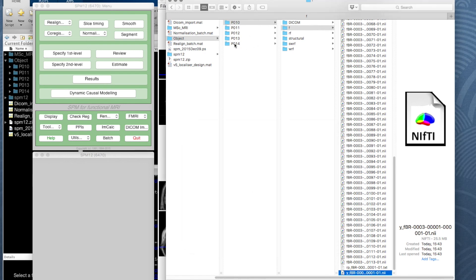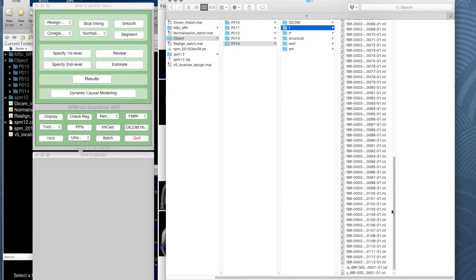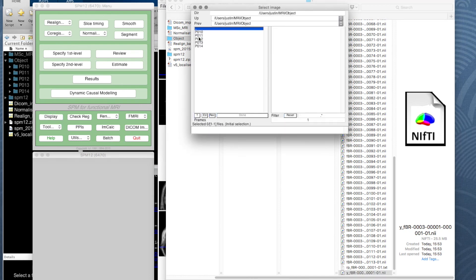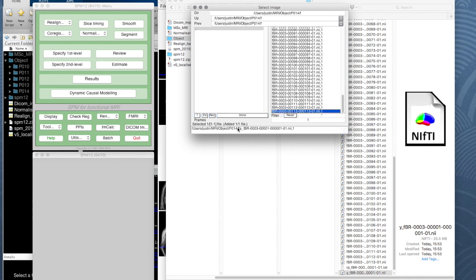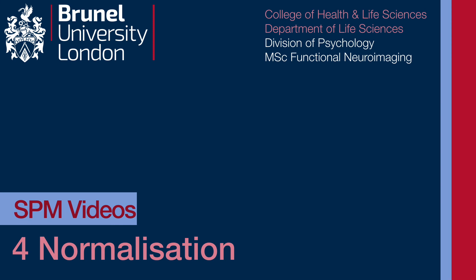Looking in participant 14's warped folder we now have the warped images. Back in the functional folder we still have the realignment parameters and the Y image, which describes the warping parameters. You could even display the Y image if you wanted to — it looks a bit strange because of the scale it's on — but it describes how to warp from the original functional image space to normalized space. You could then apply that to another image; if you ran normalize estimate only, it would have simply produced this warping parameter volume rather than reslicing images as well. That was normalization — you don't need to worry too much about how it works; just check that your images look beautiful.